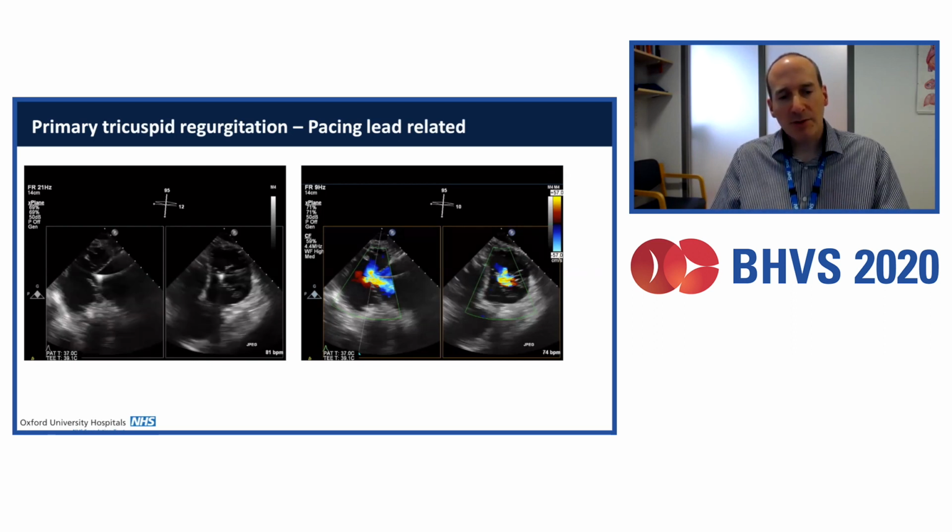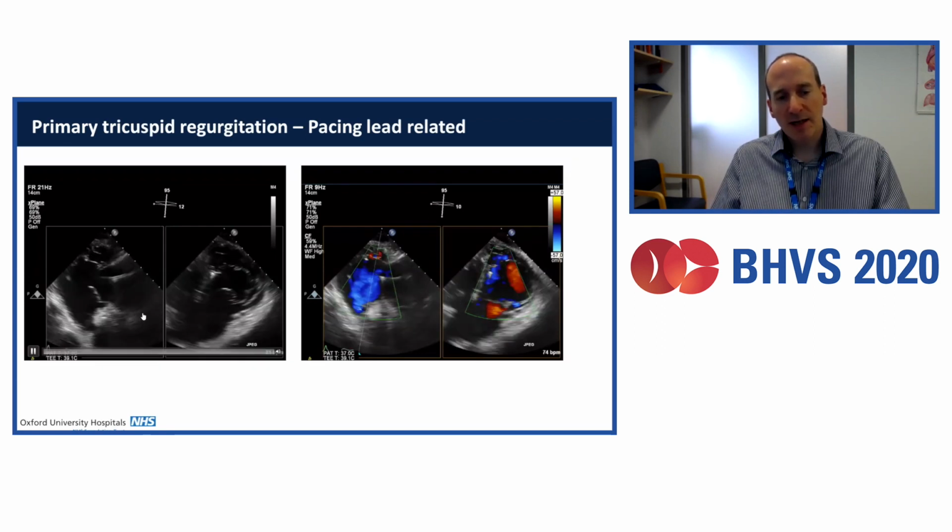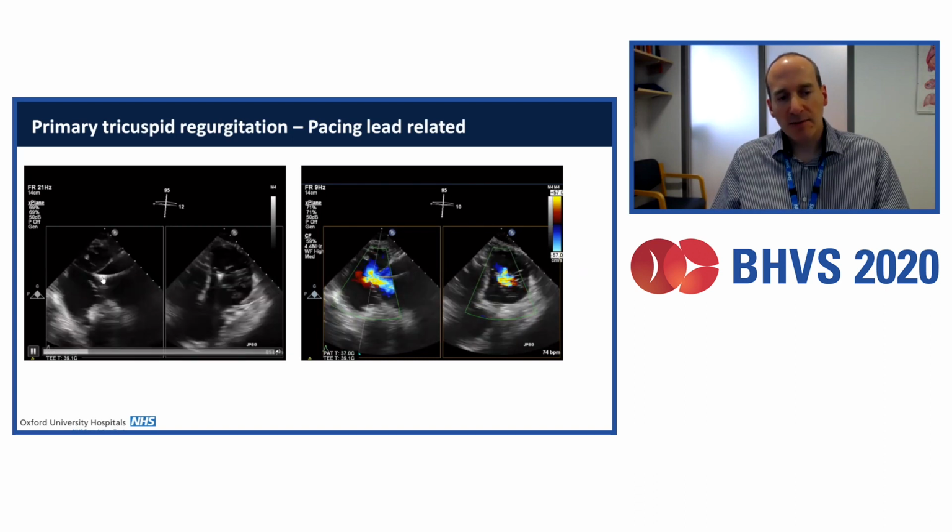Now, of course, it's important to understand this because how you might hope to improve this valve function and the options available in terms of any intervention would be critically determined by the relationship of the pacing wire to the leaflets themselves.